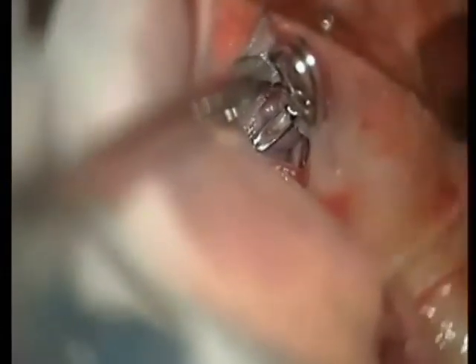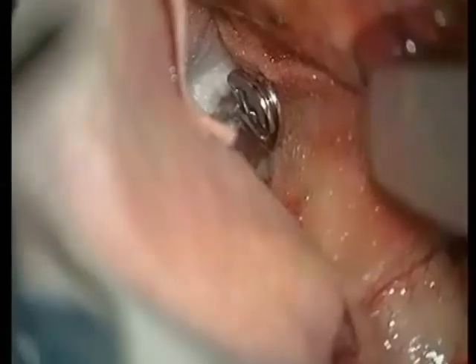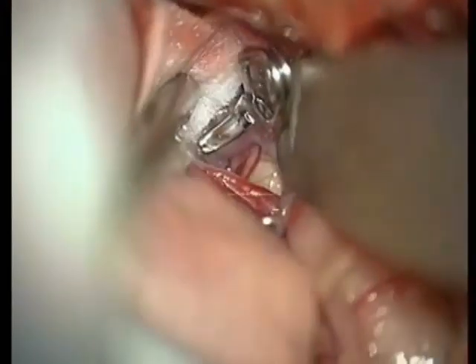ICG is used to verify that the branch originating at the base is patent, so is the M1 trunk. To get also the aneurysm remnant into the clip, we temporarily place a retractor to hold the temporal lobe out of the way.